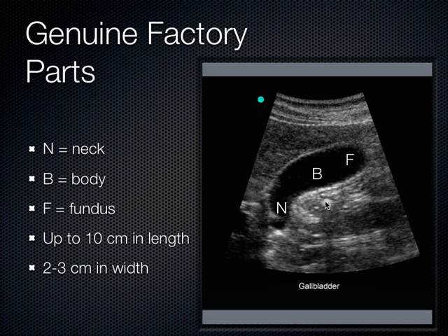Yes. Okay, now knowing that, think about how sound comes out of the probe. You think about sound being microscopically thin, but actually the sound that comes out of the probe has some thickness. In this example, the thickness of my fingers is maybe 1 centimeter. Sound is about 1.5 millimeters thick.